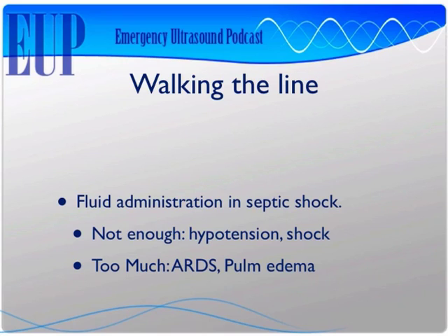We're obviously being a little ridiculous here. The concept that we're going to get it to the T isn't realistic, but what we're going to try to do is make some sense out of how much fluid, when do we give it, and when do we stop giving it, and hopefully this fluid responsiveness lecture will get us there.